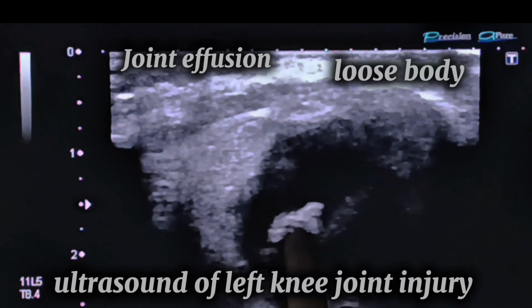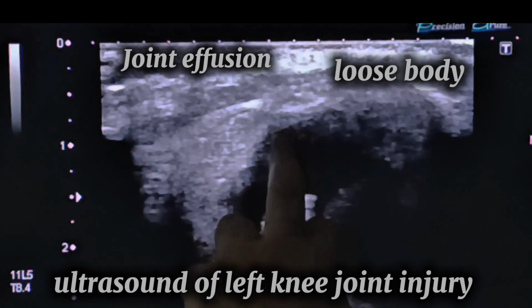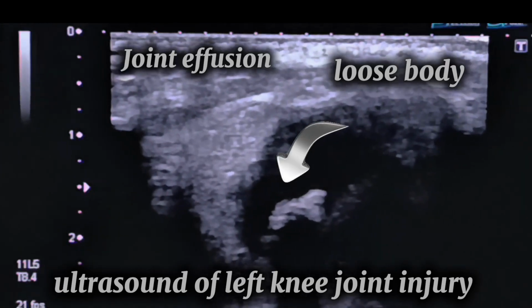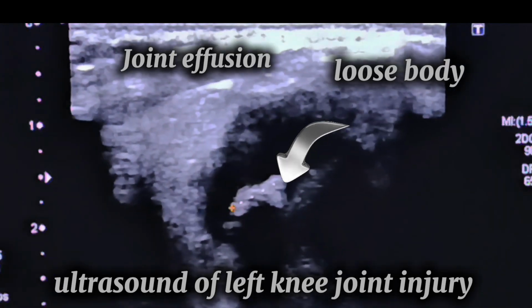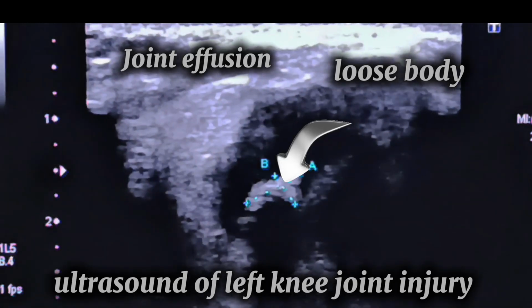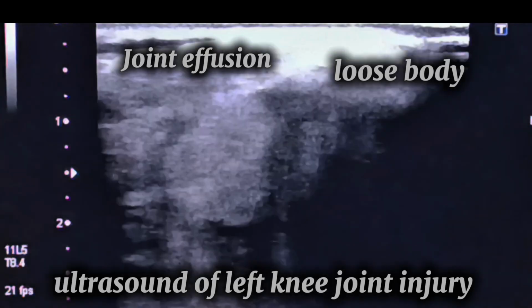Located within the lateral recess was a free-floating body measuring 6.1 mm. This showed posterior acoustic shadowing consistent with calcified intra-articular loose body. Likely, this represented osteochondral fragment due to prior trauma.